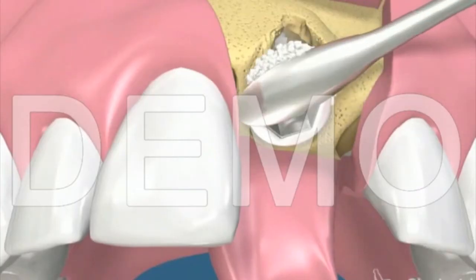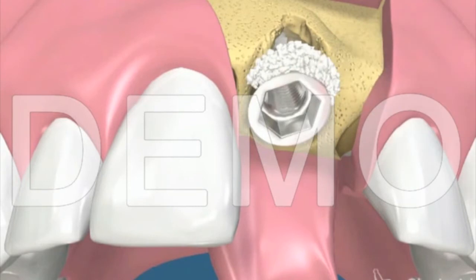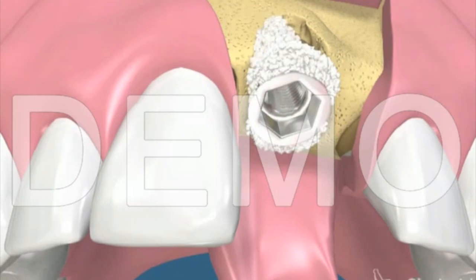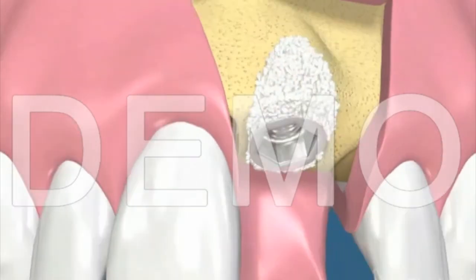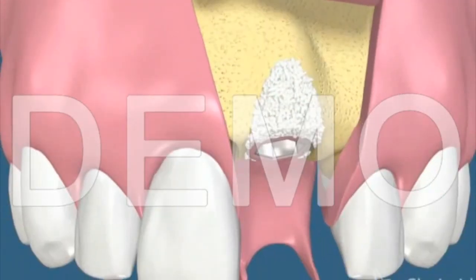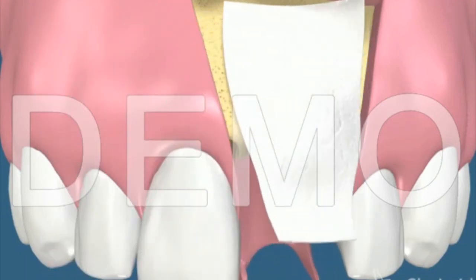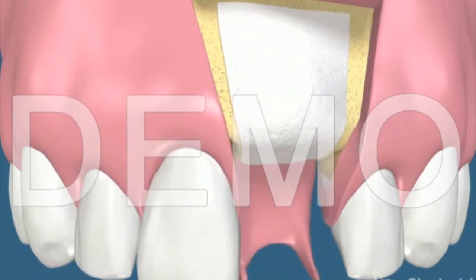Note that there is a bone defect on the one side. If this defect is small enough, it can also be corrected at the same time as the implant placement. Bone or bone substitute from various sources can be placed in the defect. The cover screw is inserted into the implant to cover the internal threads, and a resorbable membrane can be used to cover the area to help with healing.